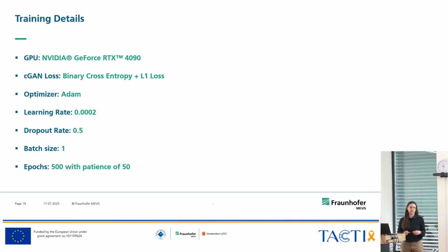But I want to make sure that the commonly used quantification tool can be quicker, and we can train on less data. The question was why I don't use data augmentation. I'm doing this right now. Normally, the problem is that we have movements in the data, and I wanted to see if we can get rid of some images and still get maps.